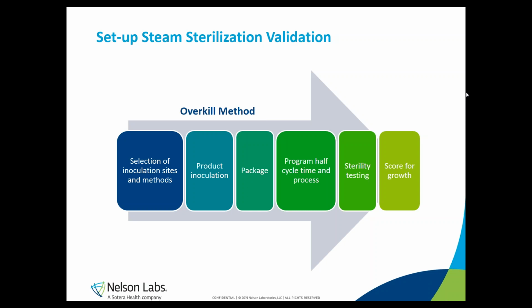Then finally, all biological carrier materials or the inoculated products themselves are aseptically submerged in growth medium and then incubated at appropriate conditions. After incubation, the growth medium vessels are then inspected for the presence of microbial growth. In the next slides, I will go into more detail for each of these steps.